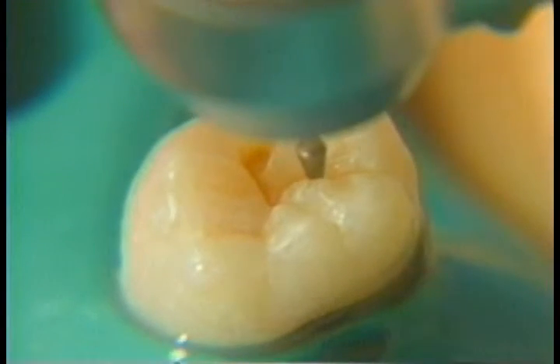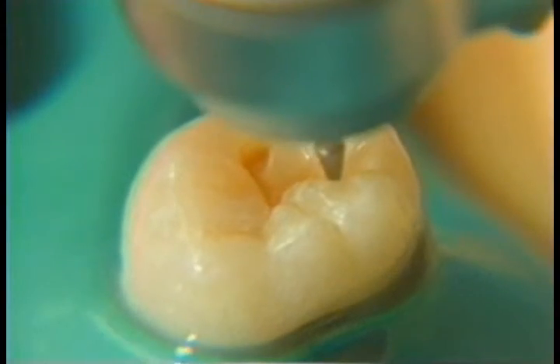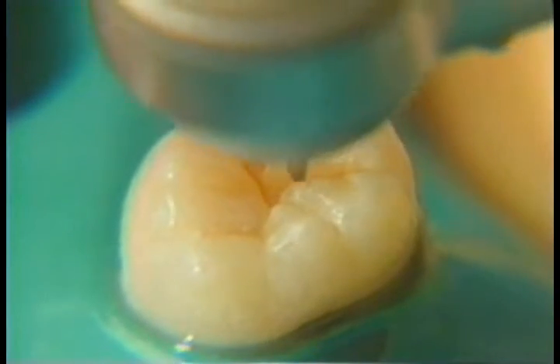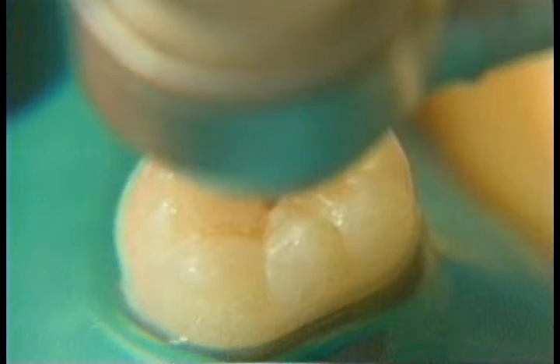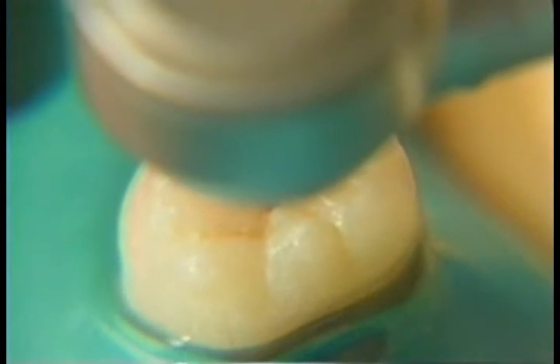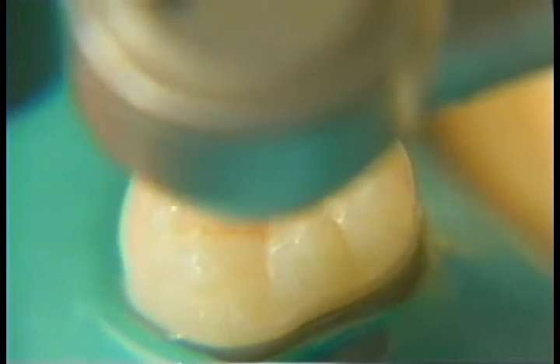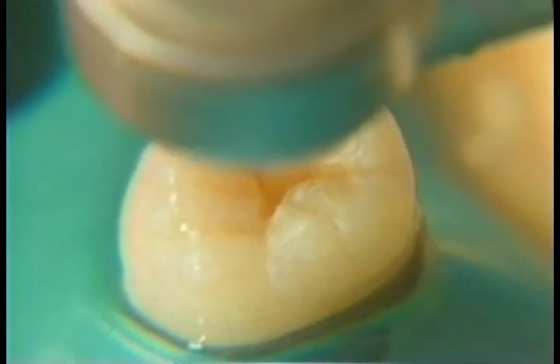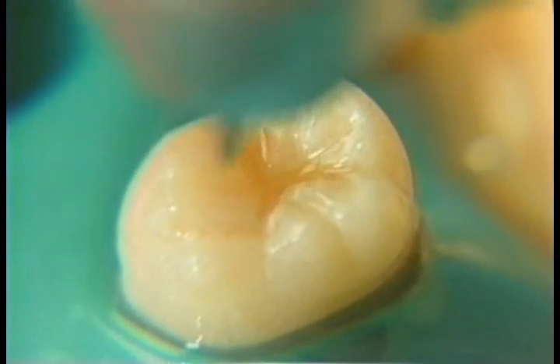We'll go just slightly into this fissure — yes, there's a little decalcification there too. Just plasticize this area slightly so that we can seal it. The rest of the system looks healthy and does not look suspicious, so we won't even prepare it.